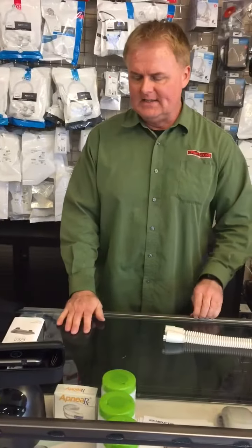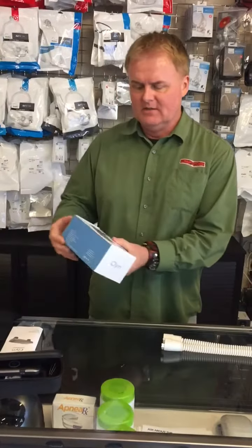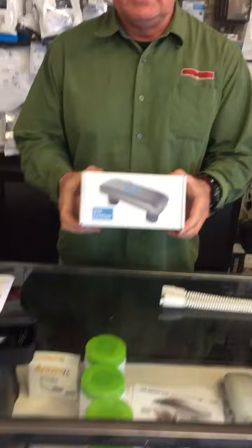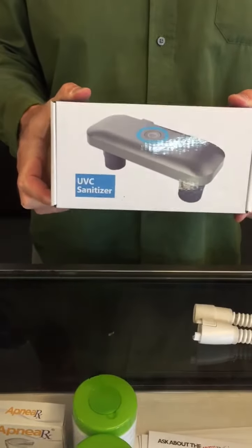Today I would like to introduce to you a new product that we have. It is a clean UV hose sanitizing machine. It is an accessory. Basically, what this does is it uses ultraviolet rays to kill pathogens inside your hose.